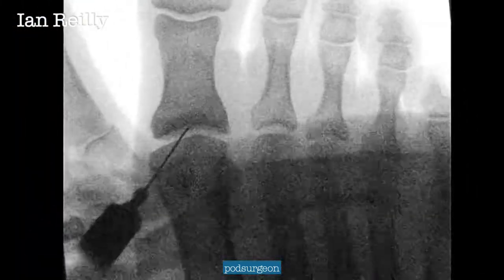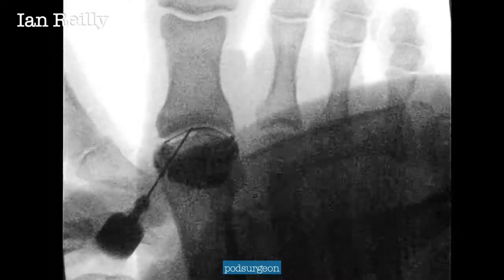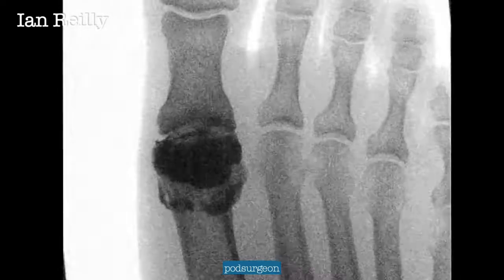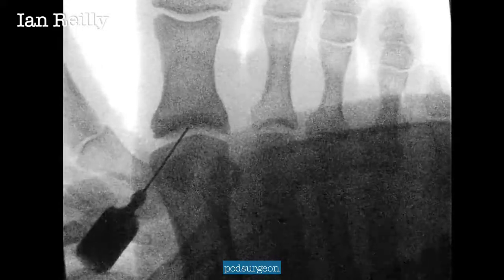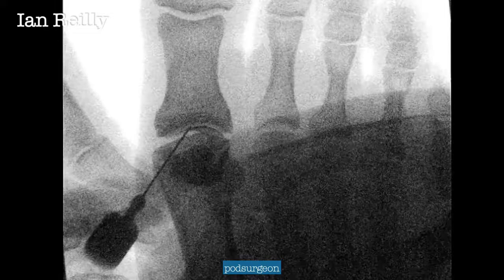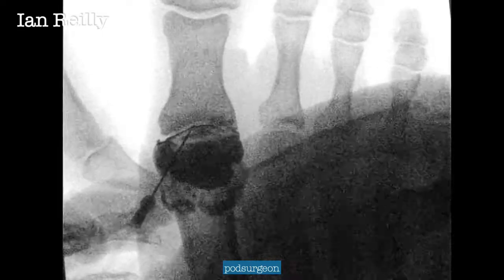And then a short live cine video of the technique. Here's a slow-down video of the same technique, slightly more dorsal to plantar than is my normal preference, but sometimes you've got to do what you've got to do. You can really see the dye going into the joint and coating the base of the proximal phalanx and the head of the metatarsal. It gives you a really good confirmation of needle placement before you inject the steroid.